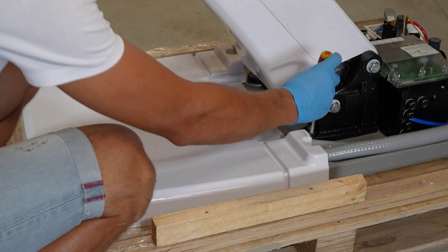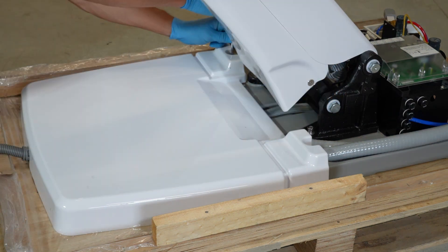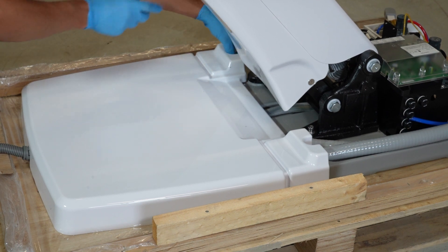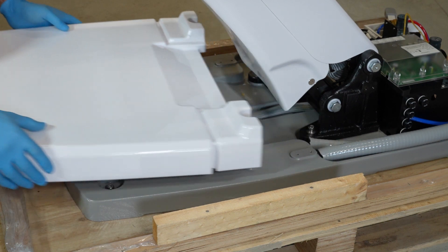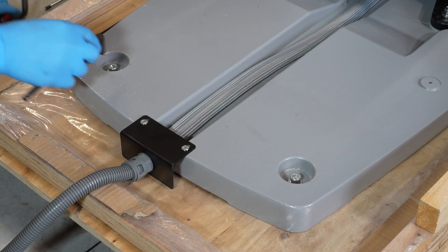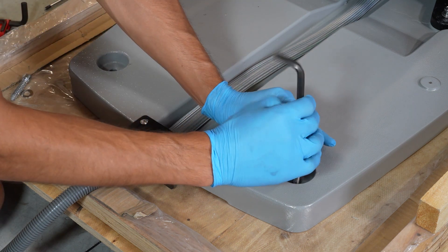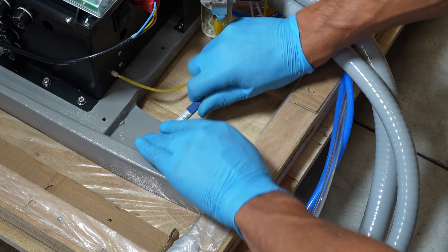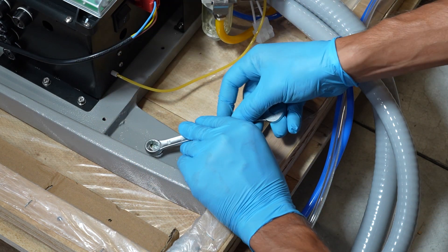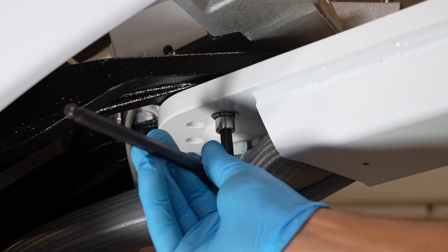Remove the rear cover at the chair base. Remove the screws fixing the unit to the pallet. Remove the screw fixing the water unit arm.